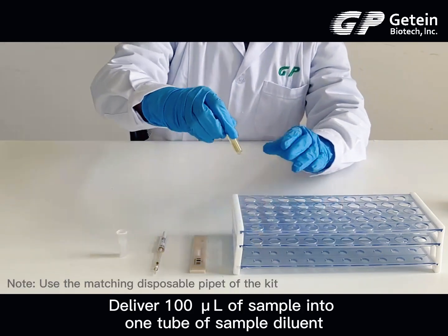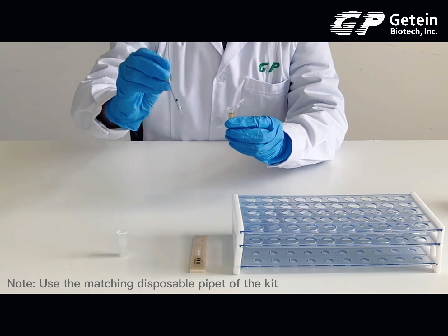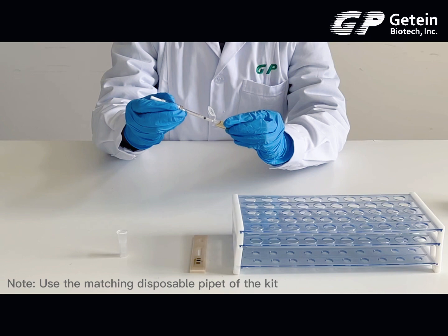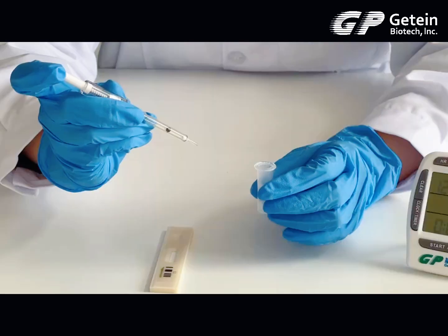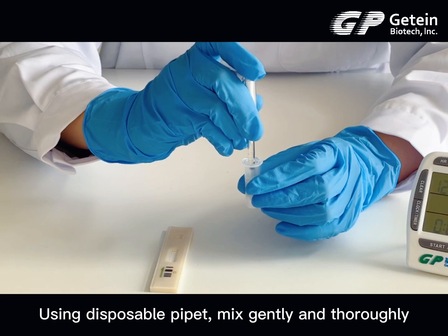Deliver 100 µL of sample into one tube of sample diluent. Please use the matching disposable pipette of the kit. Using the disposable pipette, mix gently and thoroughly.